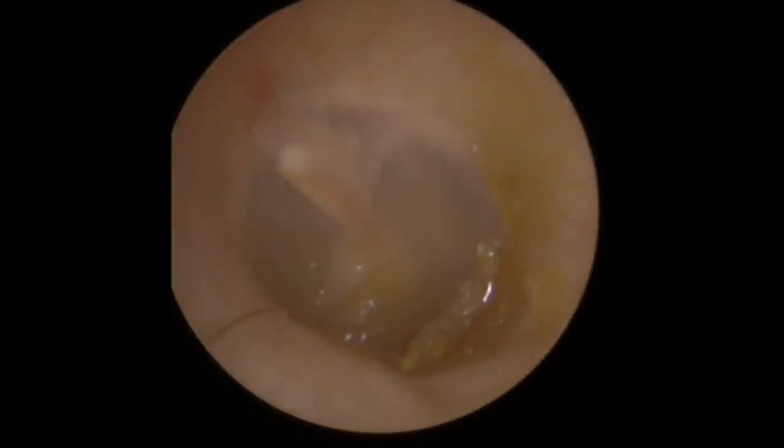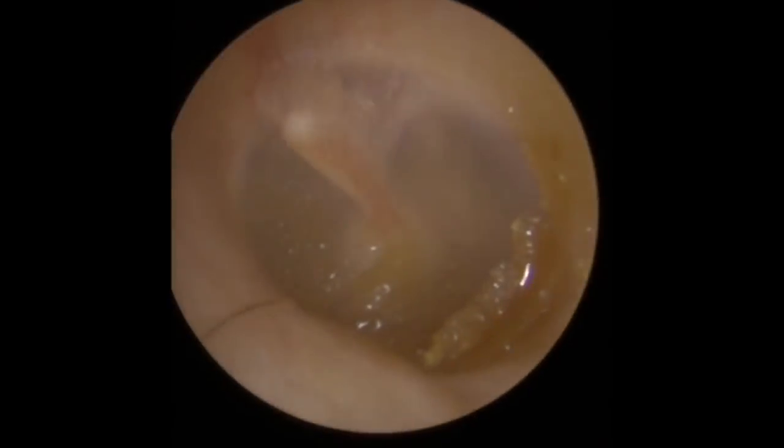So this is the patient's other ear. So I'm just going to pause it in a second, and I want you guys to take a look at this eardrum and see what you think is wrong with it. This was actually missed by an audiologist, so patients come through with reduced hearing on this side but couldn't quite work out why that was happening.